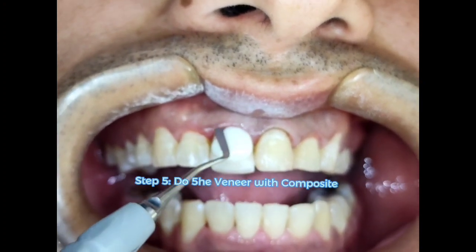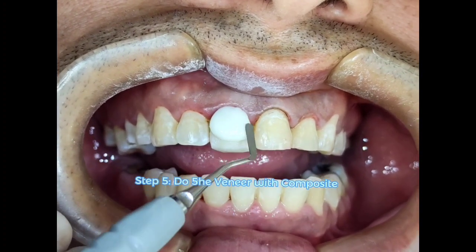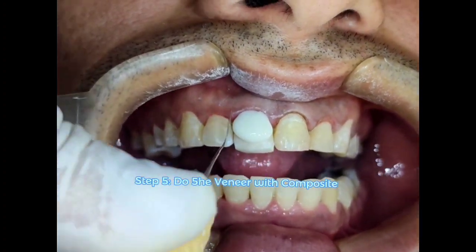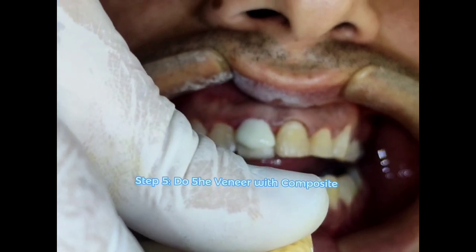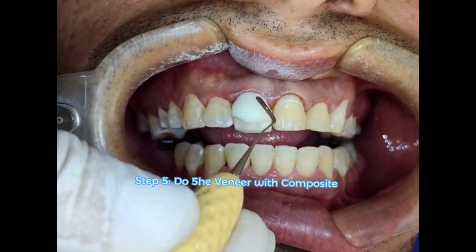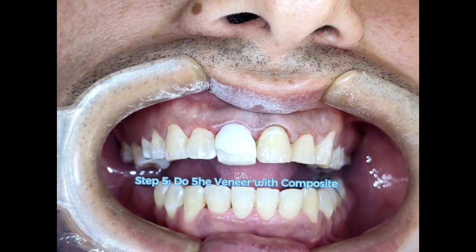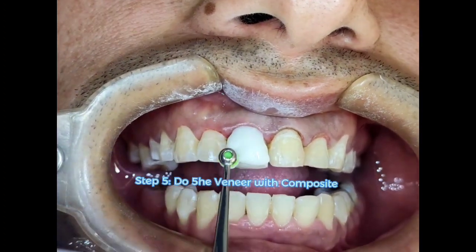And you start to do the new shape that you want to do. About the color, you need to make a decision from many factors. One is whether you want to change the color of all the teeth. For example, if you want to do a set of veneers but you have the porcelain crown, most of the time you choose a white color composite. In this situation, I use a white color because I need to change the color of all the teeth. I am going to do veneers on all the teeth.